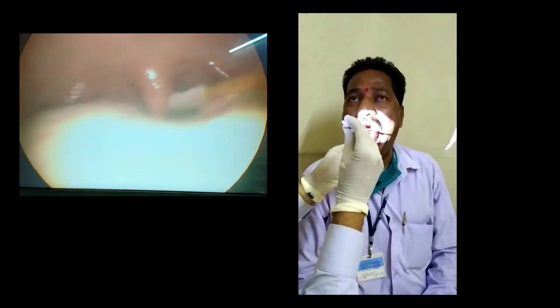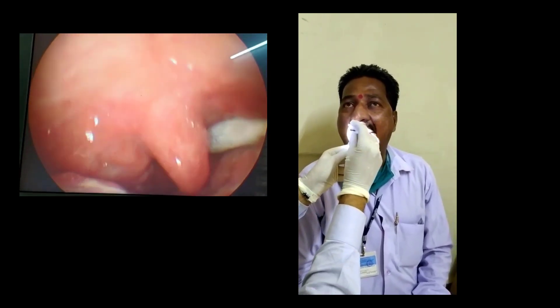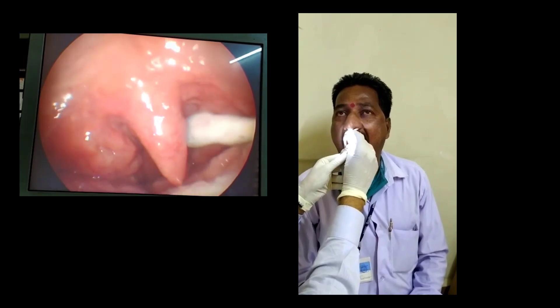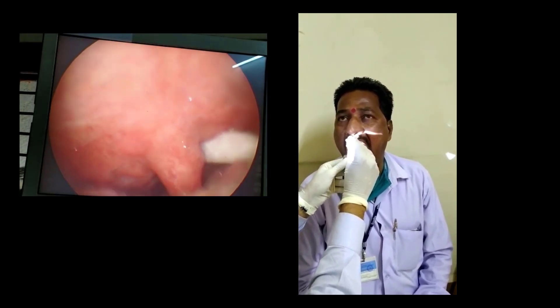I will not contaminate with the saliva — that is, I will not touch the buccal mucosa or tongue. I will directly target the posterior pharyngeal wall, just touching for 2 to 3 seconds, and then come out.